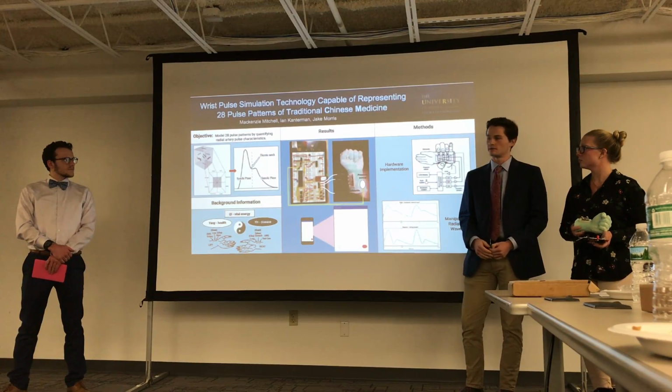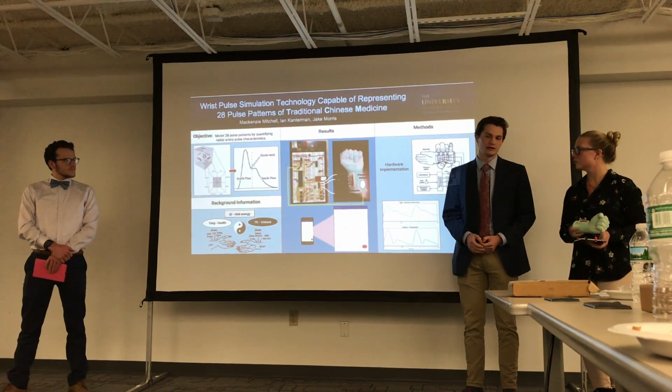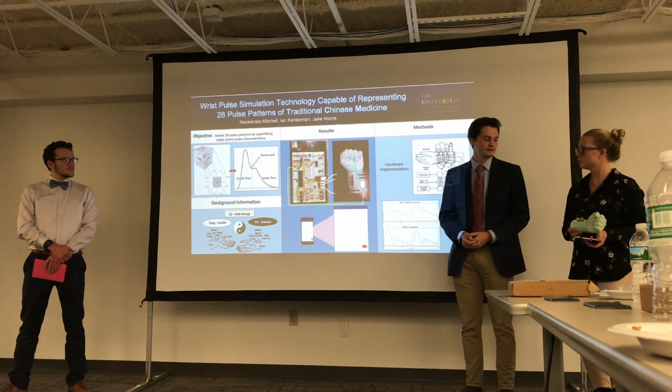And lastly, we are claiming novelty on designing variable-sized solenoid caps, which will represent the arterial width, one of the characteristics of the pulses.